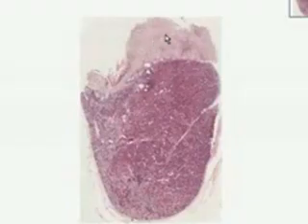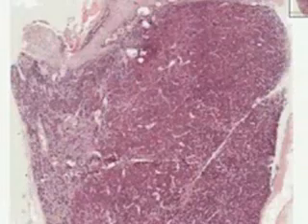There is still, even in adult life, a direct connection between this posterior lobe, which is a relatively small part of the overall pituitary, through a stalk called the stalk of the pituitary, or infundibulum as well. The hormones of the posterior pituitary are not made here. They're made in the hypothalamus, and they transfer down this stalk to produce oxytocin and vasopressin.